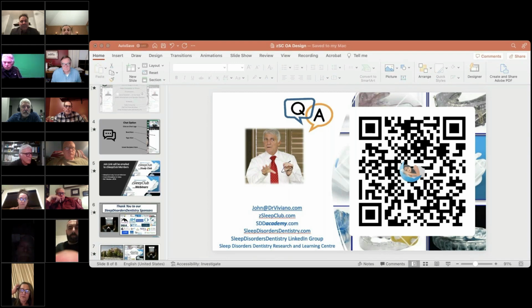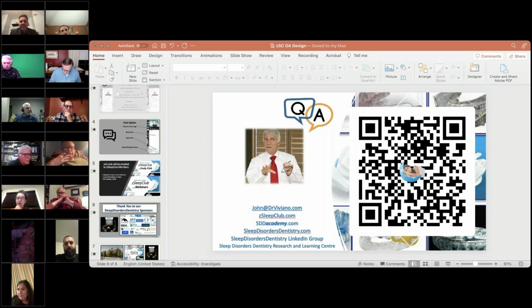I'm okay with 8. Absolutely. You know, I got to tell you, I never used 8 in my entire practice. But I retired before the real good literature came out to explain why 6 to 8 millimeters under certain situations may be appropriate. I don't think that the people using the pharyngometer or the phonetic bite are lying when they say, I used all this vertical and the patient got better. I'm not saying that all the patients needed it, but there may have been a few that in fact did, and that doesn't surprise me.